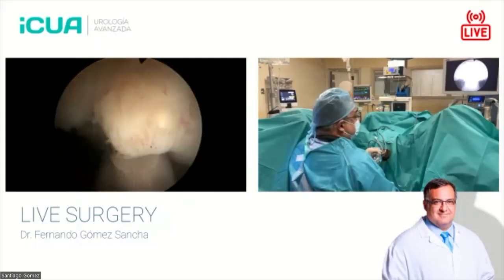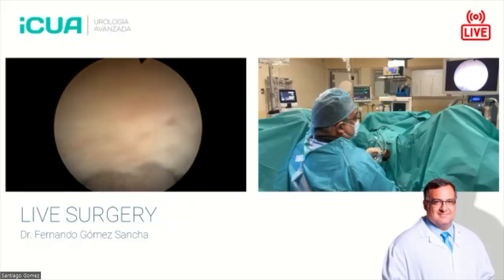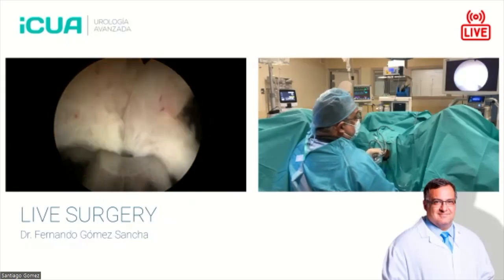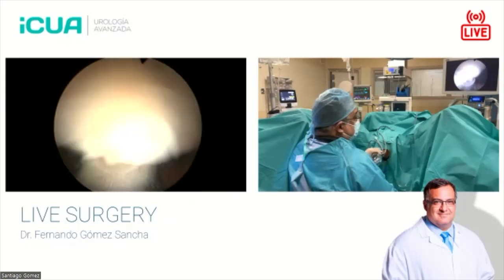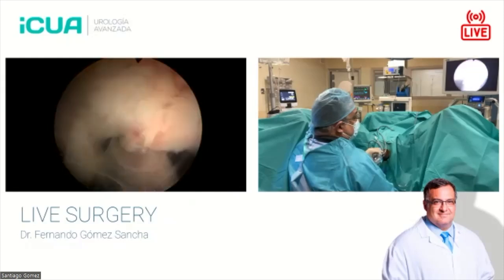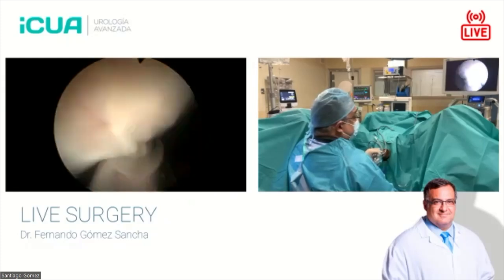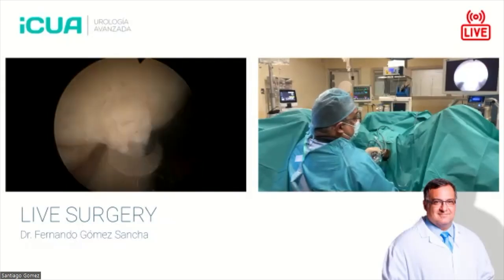What I really think is that if you looked inside every patient, we would see a lot of subclinical bladder neck strictures. I have often gone in many patients, they have not a stenosis, but a very close bladder neck, it closes like a photographic camera diaphragm, and maybe the caliber is 30 French, and they have incredible flows. They're so happy, but still they have some degree of bladder neck contracture.